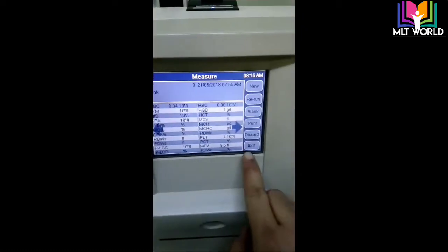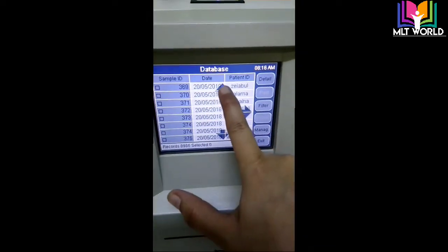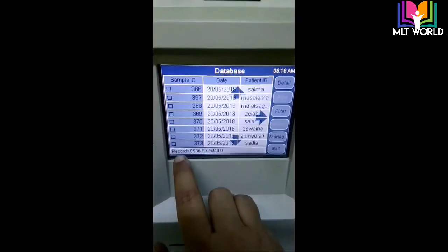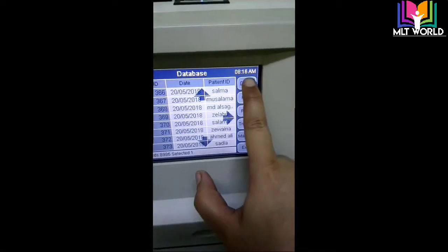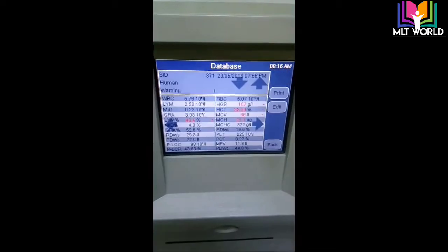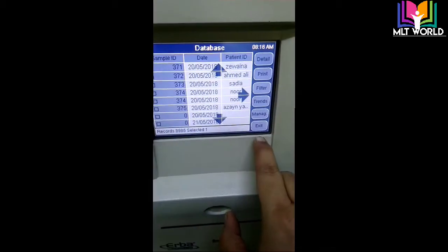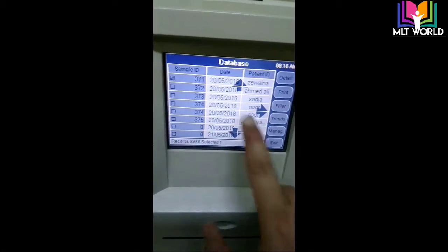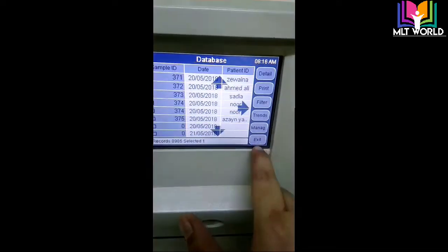Now I will show you the other functions of this machine. In the database there is the history of all patient results. If we want to see any patient result, I will click on it and a tick mark will come, then I will click 'detail' and the result will appear. If I want to delete a result, I will mark it the same way, go to 'manage', click 'delete', and click OK — it will be deleted.